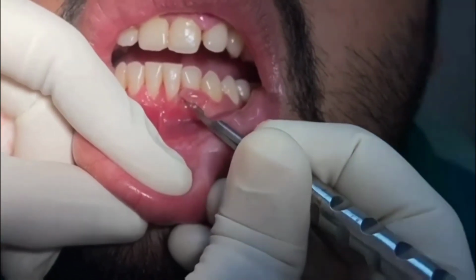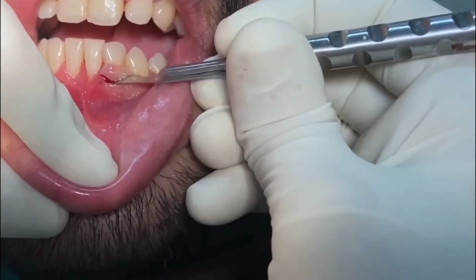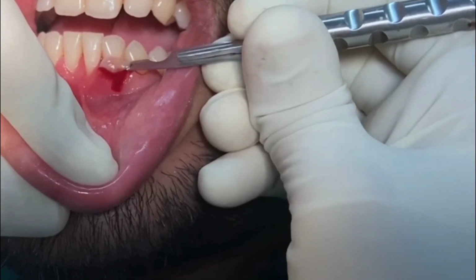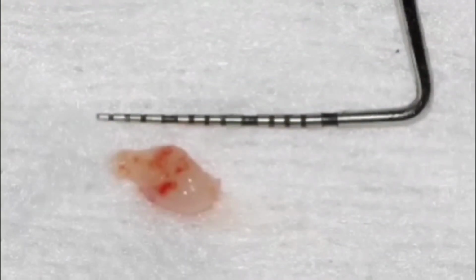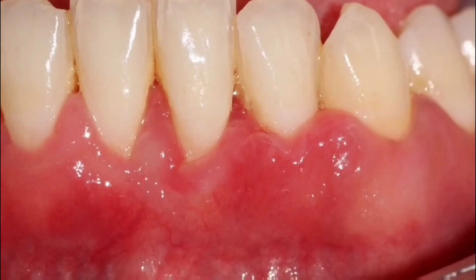Incision is carried out with the help of an external bevel gingivectomy, wherein the blade is held at a 45-degree angle towards the tooth surface and the tissue is excised. The excised tissue, and this is the post-op photograph.